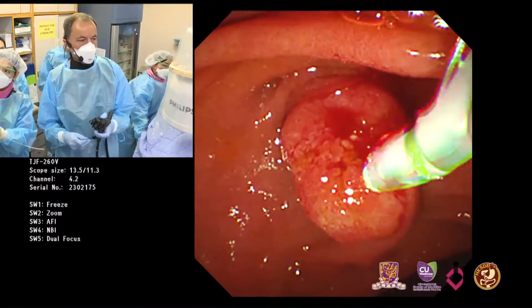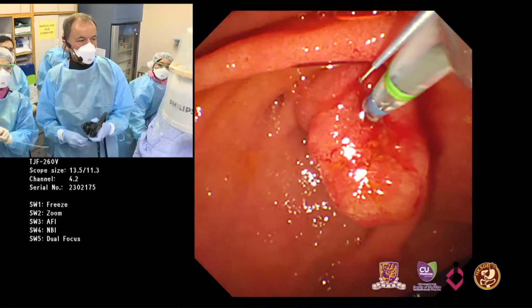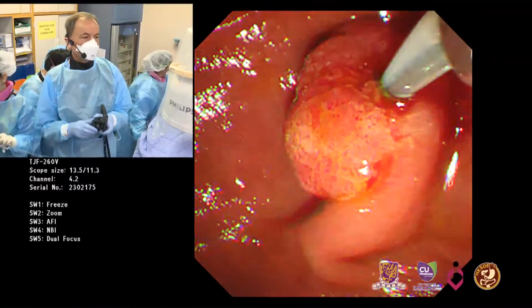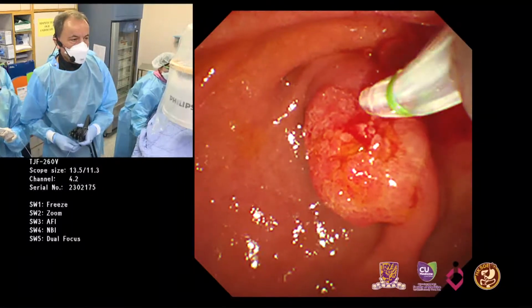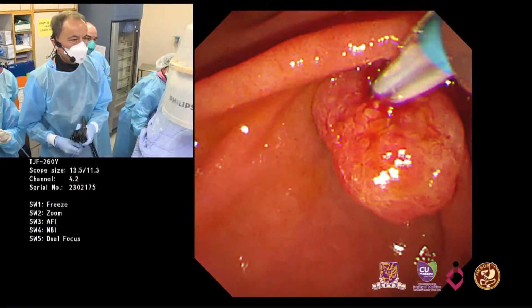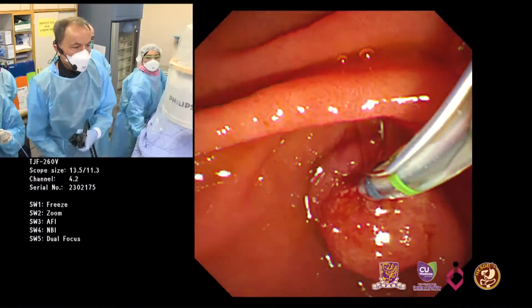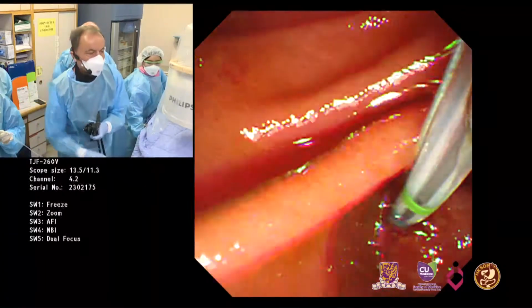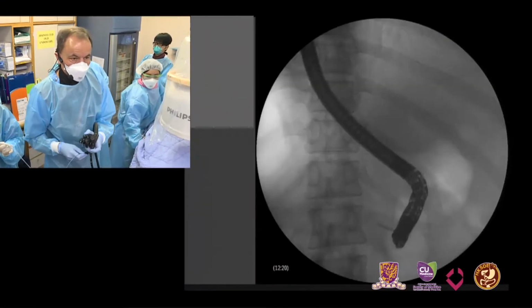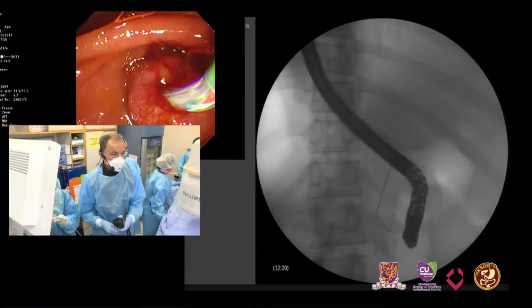I will recannulate now with a clever cut sphincterotome, and I cannulate at the upper edge of the sphincterotomy. So then I get at the very proximal edge here. I lift the papillary roof. Okay, try it again. Yes, biliary duct. All right.